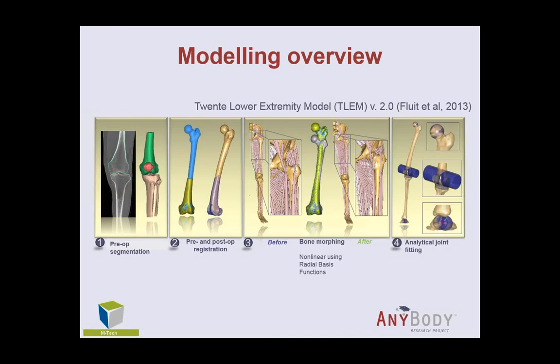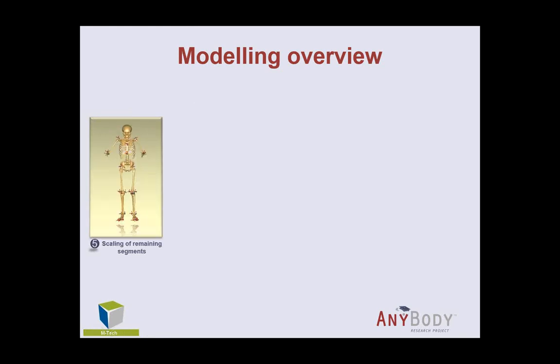We also tried to find the axis of the tibiofemoral joint and the patellofemoral joint by doing cylinder fits to the implant, as you can see here. And actually this particular implant is very circular, so a cylindrical fit is a very good fit. For the ankle, we fitted 2 spheres to the top part of the talus, and then found the ankle axis as the line connecting the 2 origins.